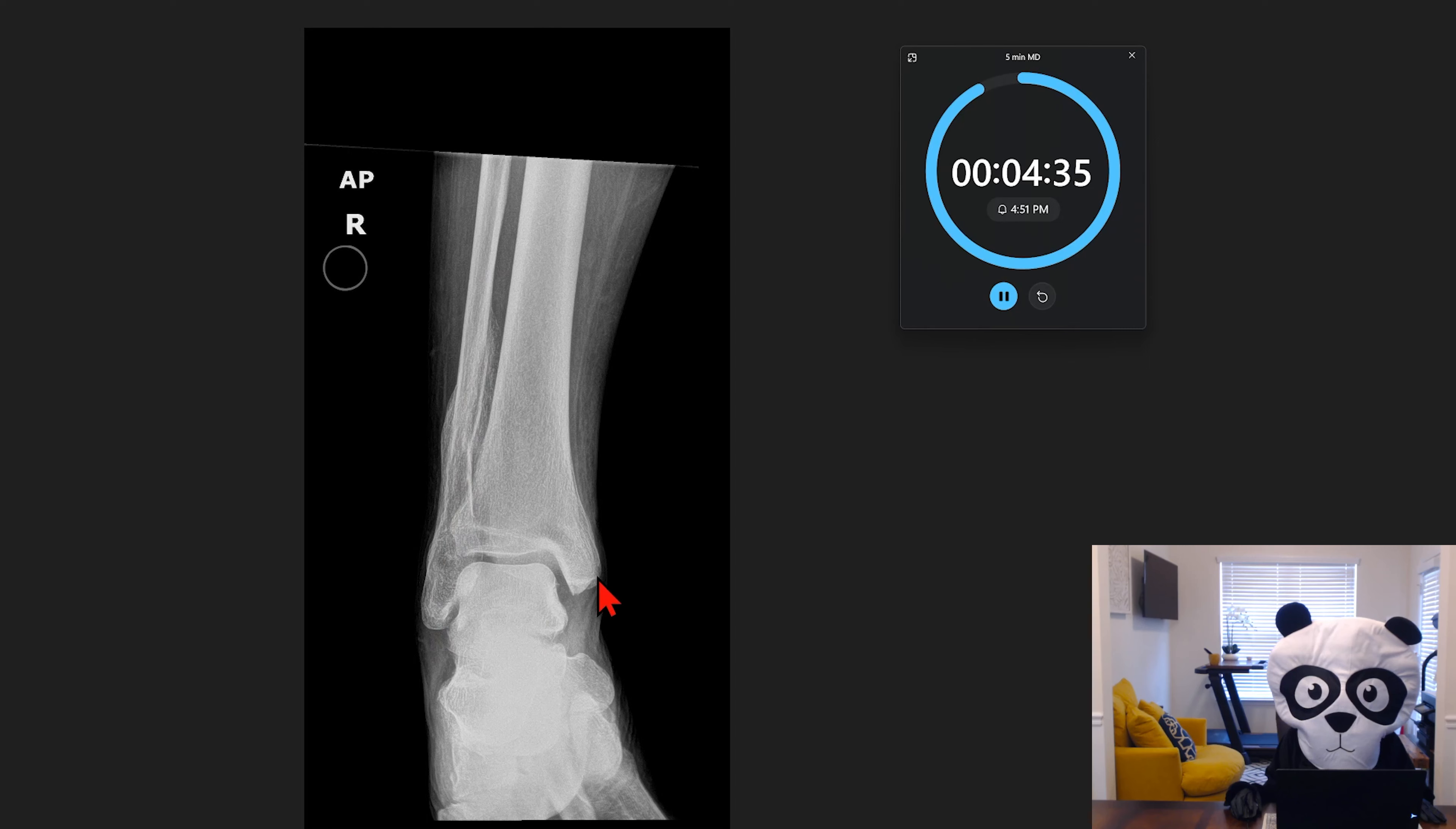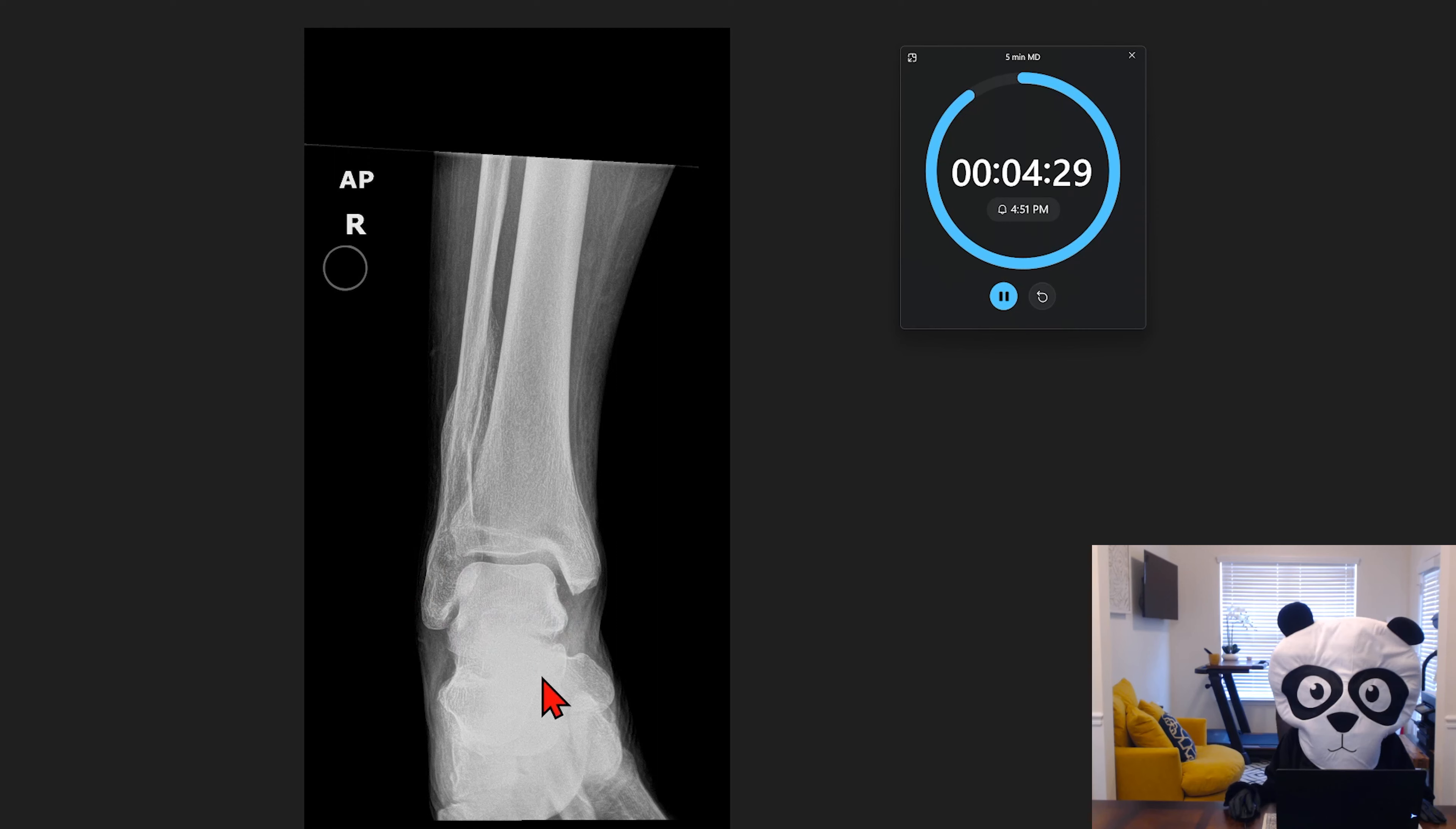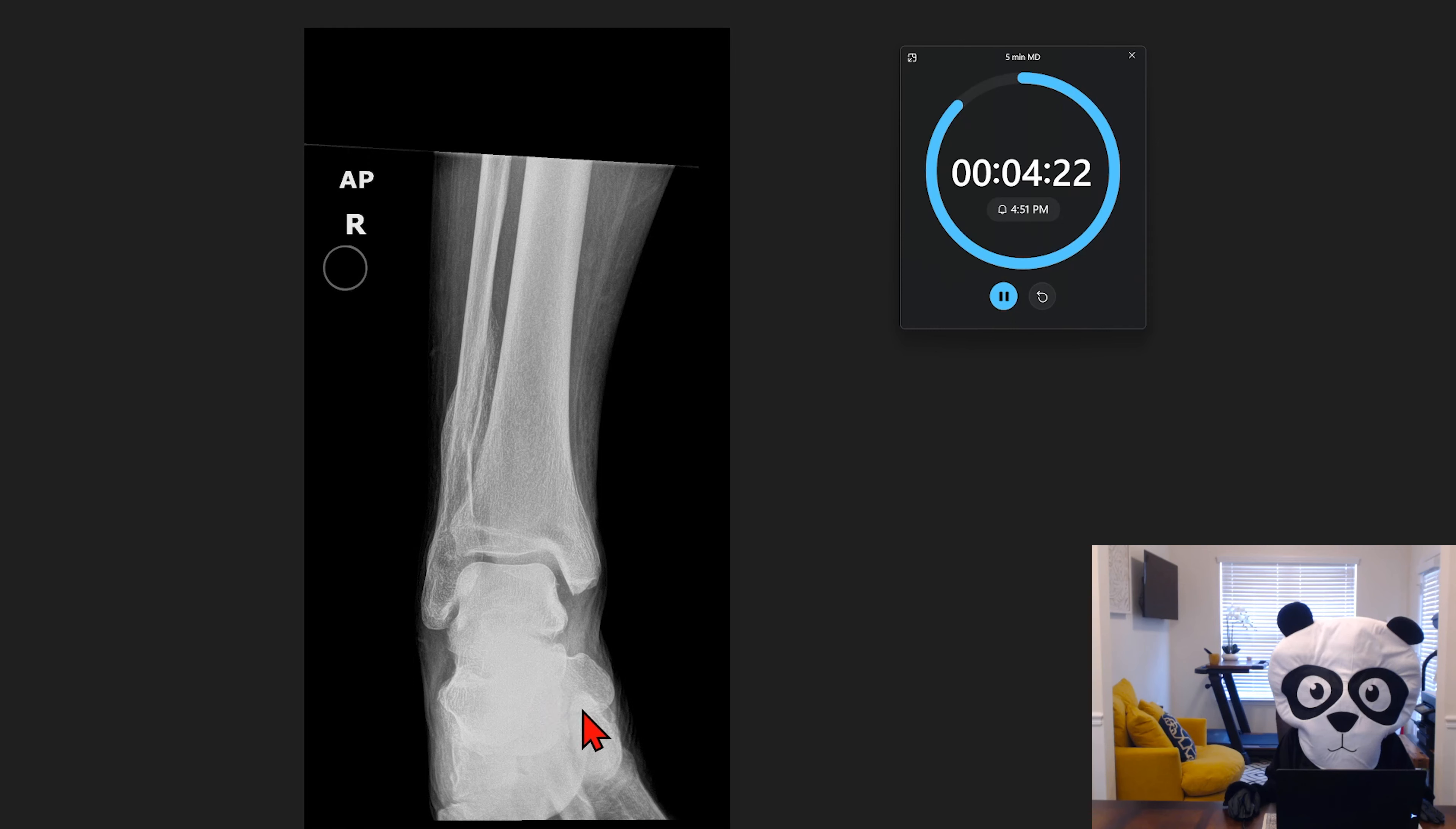We have the medial and the lateral malleolus. We have the talus here. We have some additional joints involving predominantly the midfoot, but on the AP view, as we can see, most of these osseous structures are superimposed.